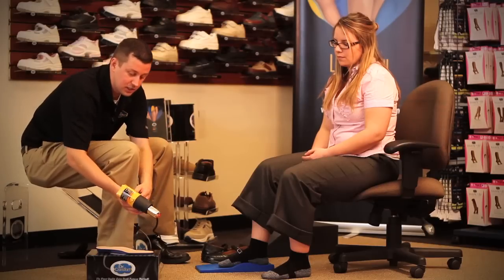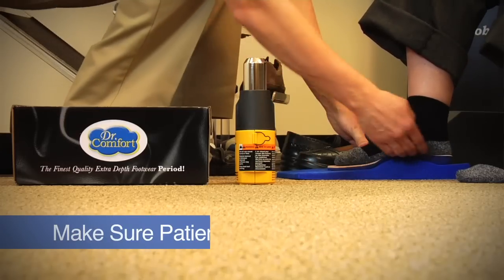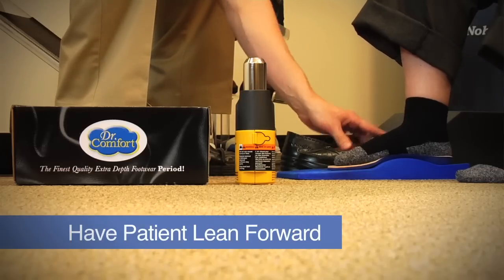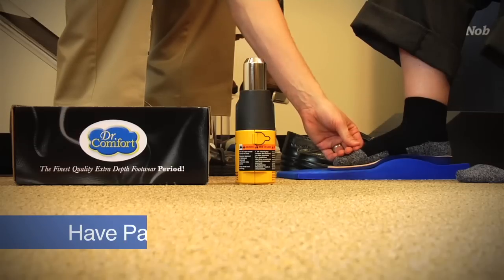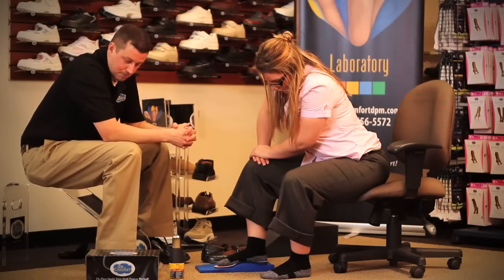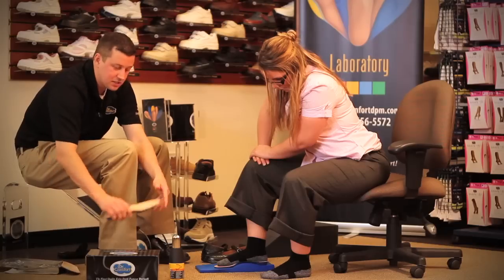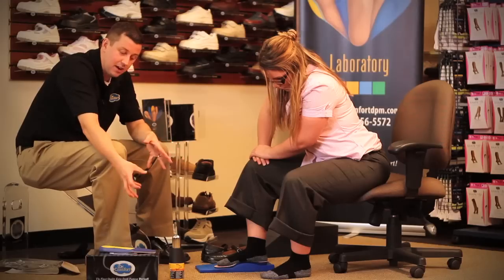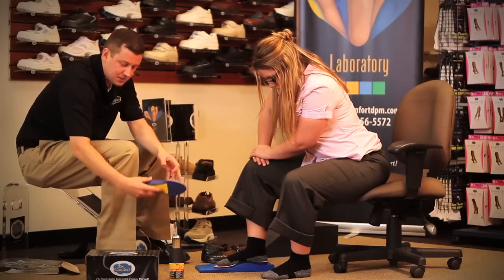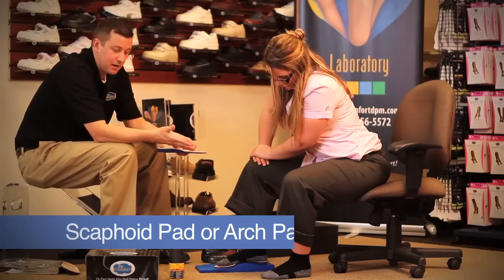After heat molding sufficiently, turn the heat gun off, then properly position the insert on the patient's arch and foot using the molding block available from Dr. Comfort, pushing up on the insert to meet total arch contact with the patient's foot. Ask the patient to lean forward to put a little more weight and pressure on the insert to help achieve arch contact. Because you're dispensing and billing Medicare for three pairs, you want to heat mold all three pairs at the same time. However long you heat mold the insert is approximately how long the patient should apply pressure. If the insert does not achieve total arch contact, add a scaphoid pad — also called an arch pad — to the insert.